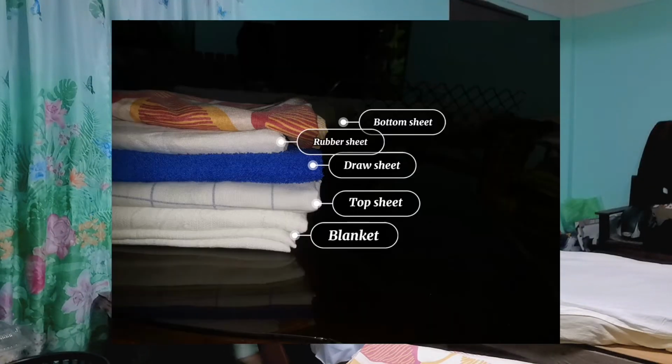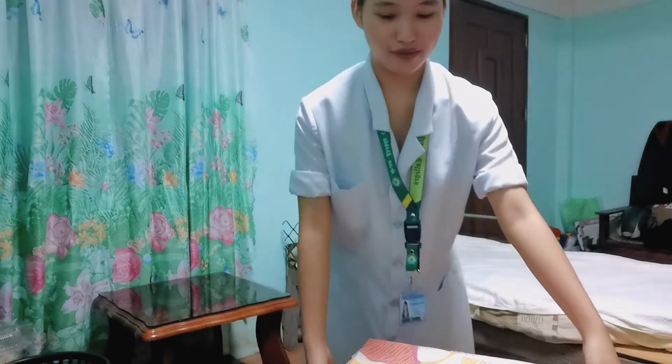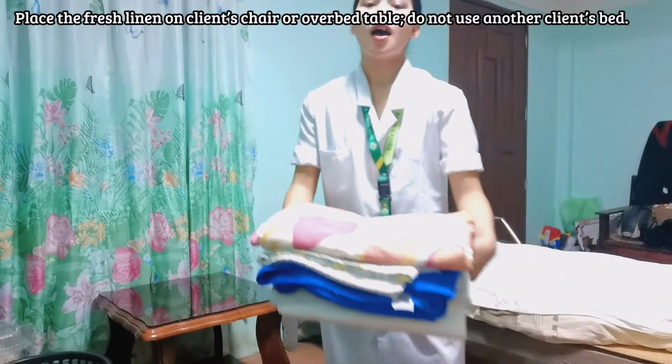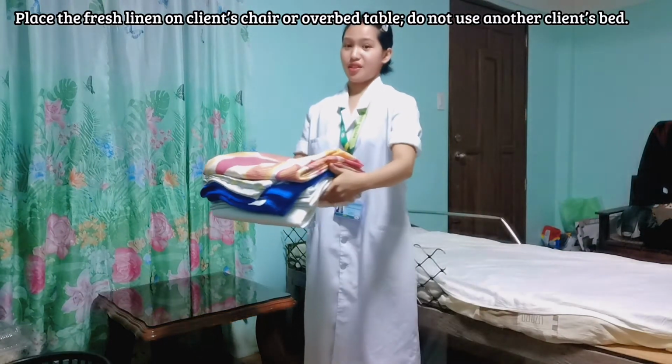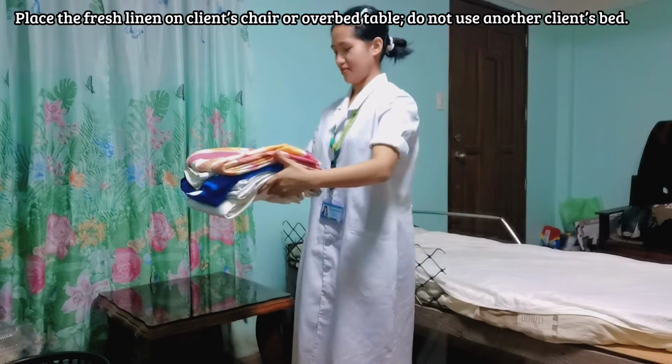After that, I'm going to gather all the linens and place them on a clean surface of the room in the same manner in which they will be placed on the bed. I'm going to make sure that the linens do not touch my uniform to avoid contamination.